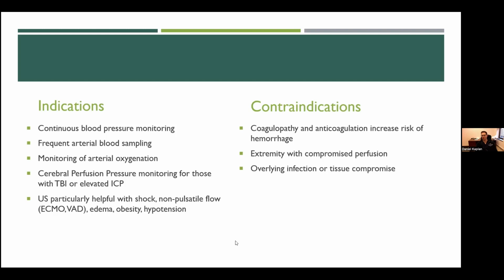When you're trying to target specific cerebral perfusion pressures, it helps you precisely target those. And overall, you can do these without ultrasound, but ultrasound is particularly helpful with patients who are in shock with thready pulses, or on ECMO with non-pulsatile flow. They're edematous, where it's hard to really feel the artery, they're obese, or they have significant hypotension.